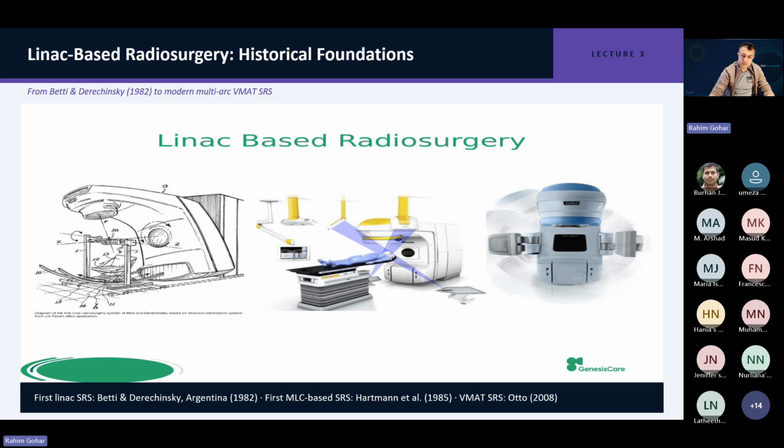But as I mentioned earlier as well, with the advent of external imaging capabilities from third-party vendors, particularly compatible and very good workflows with these kinds of linear accelerators, whether it's Varian or Elekta, they have made our life very easy.